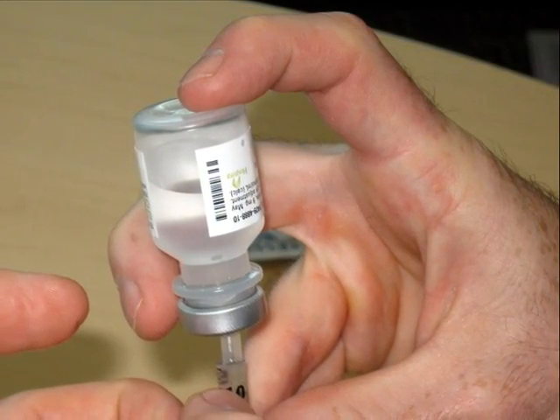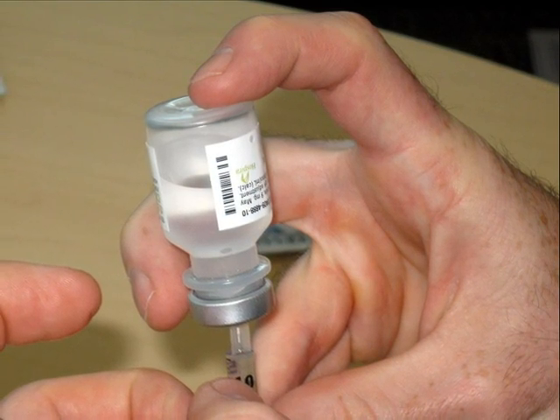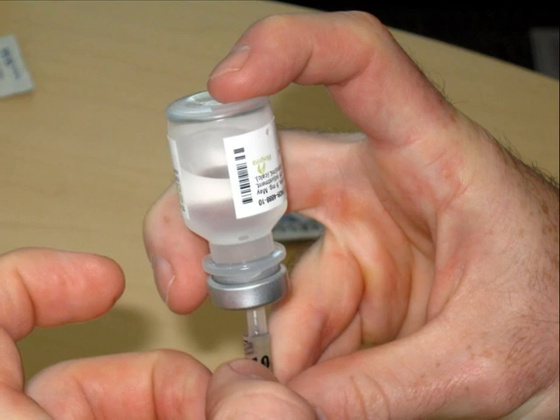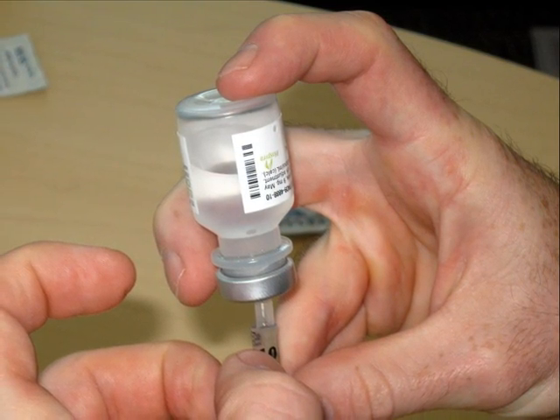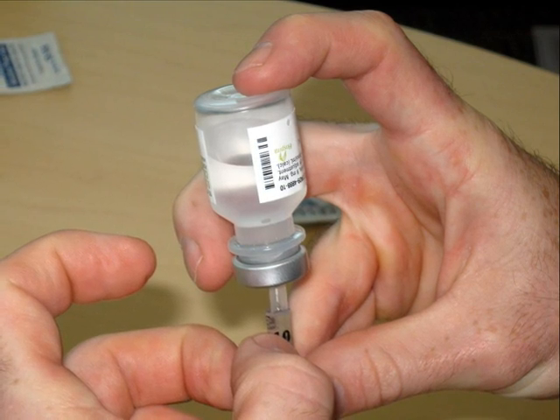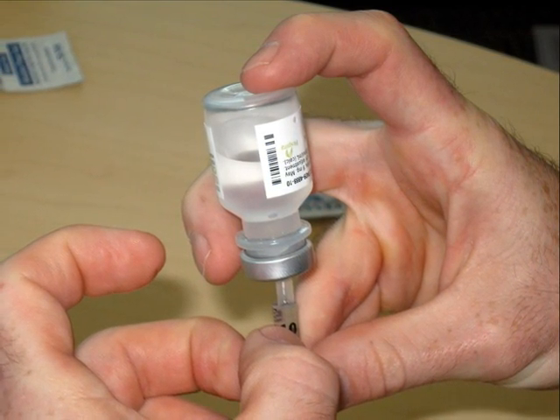Take a look inside the syringe. If you see any air bubbles, tap the syringe gently until the bubbles rise to the top. Then, slowly inject the air back into the insulin vial. When this is done, redraw the correct dose of insulin.